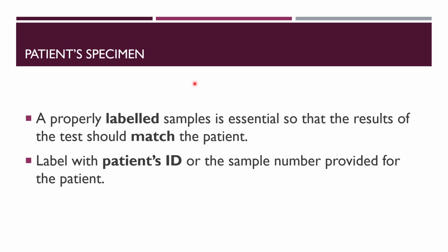So the patient's specimen, whenever we are handling any specimen, majorly you all as PGDMLT students will handle blood. If we talk about any specimen in a PGDMLT laboratory or paramedical laboratory, they all should be properly labeled.